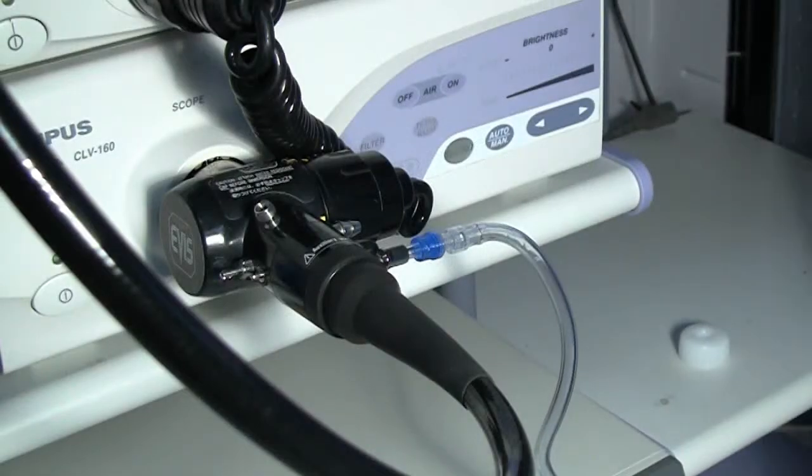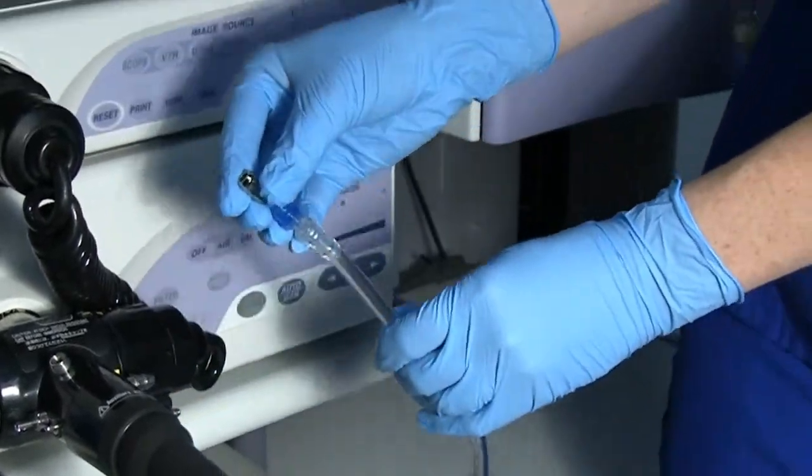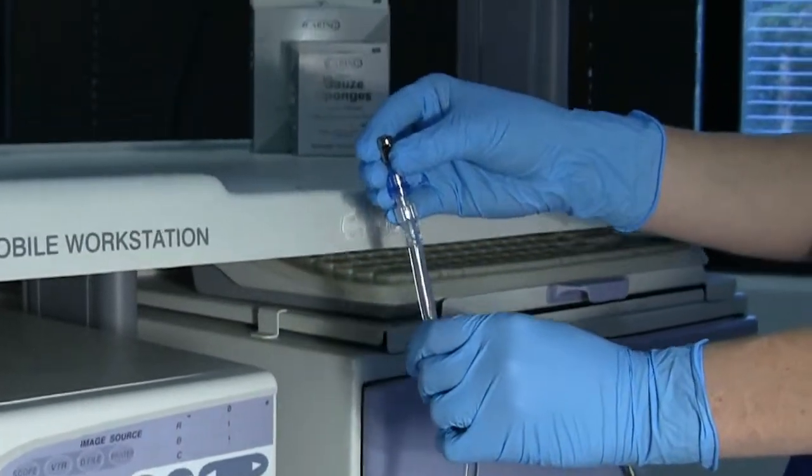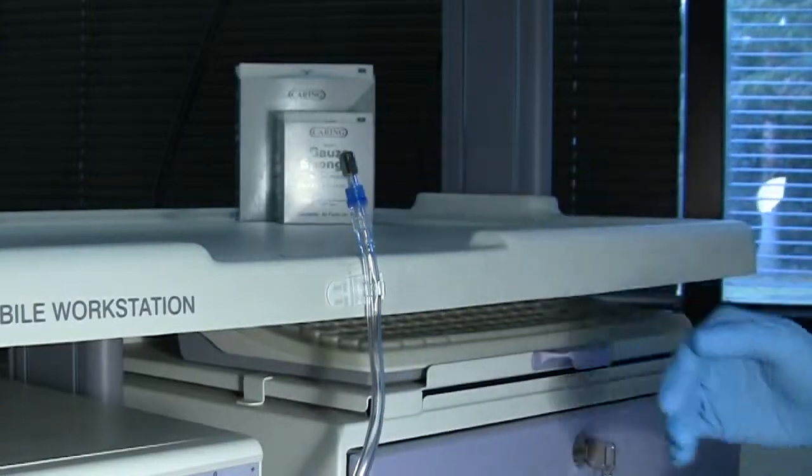After the case has ended, take the endogator tubing and connector and disconnect it from the scope, maintaining a clean distal tip. Then place the tubing on the tube connector stuck to the trolley. When you are ready for your next case, simply reverse the steps.